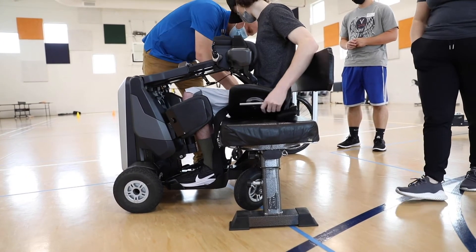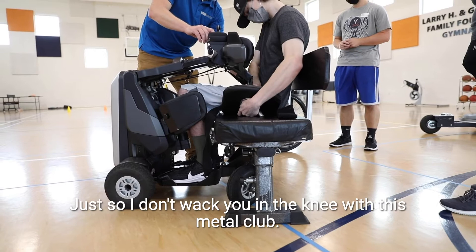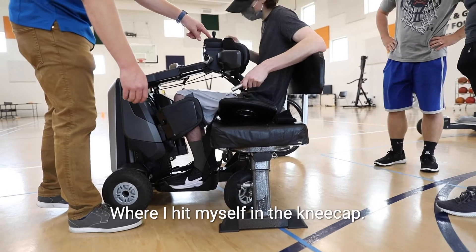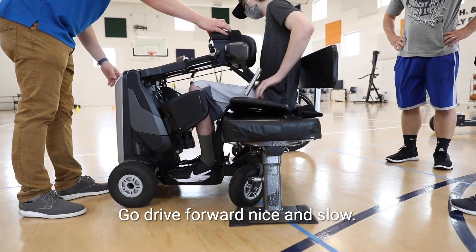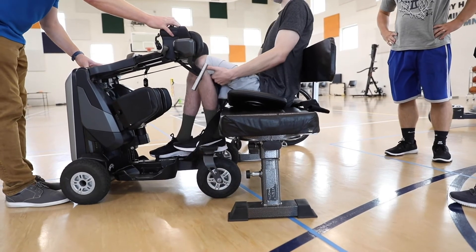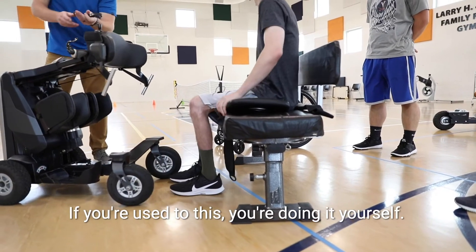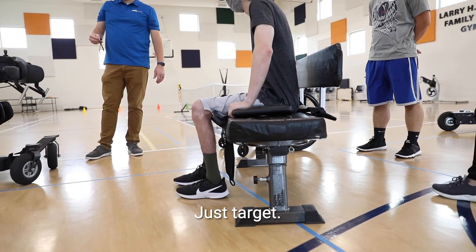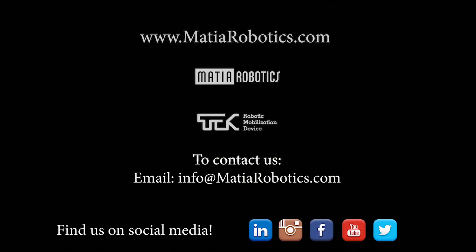Do those and then just send those out on the other side. I'm going to tighten it back up just so I don't whack your knee with the metal — I've done it myself where I hit my own kneecap. Now I'm going to drive the floor nice and slow so you can get your feet up. If you're used to this and doing it yourself, you can just use the remote — send it completely out of the way, just park it and forget about it.